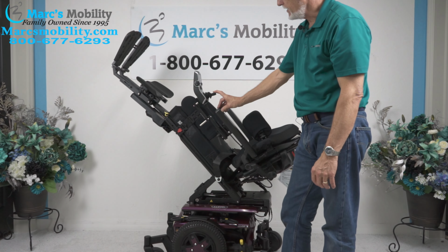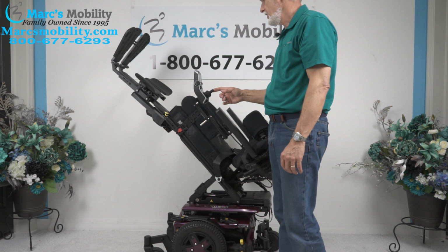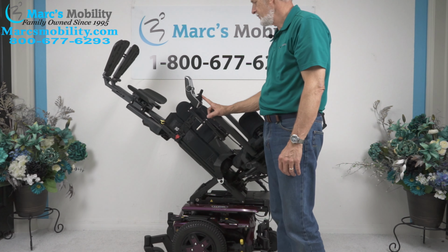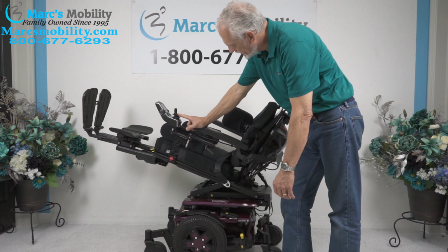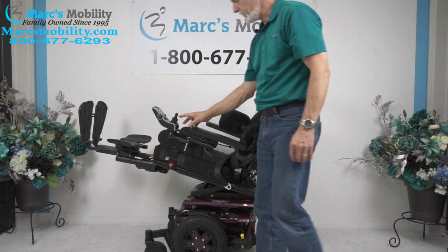So this way here, you're definitely going to have your feet higher than your body, but you could also be halfway tilted. This would be halfway tilted here, and still have your legs above your body. So even right here, your feet are still higher than your body, okay?